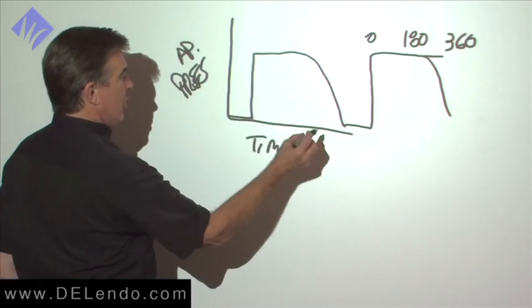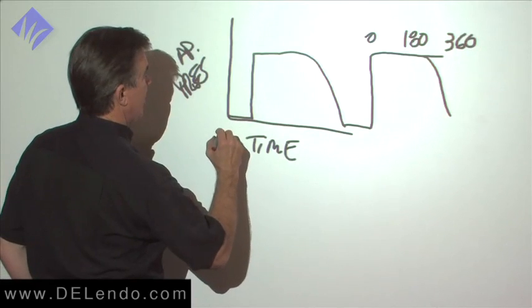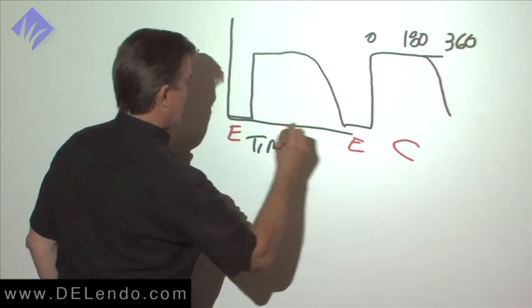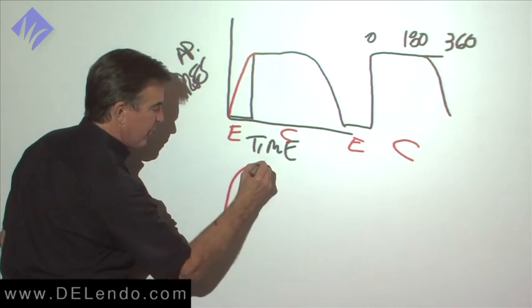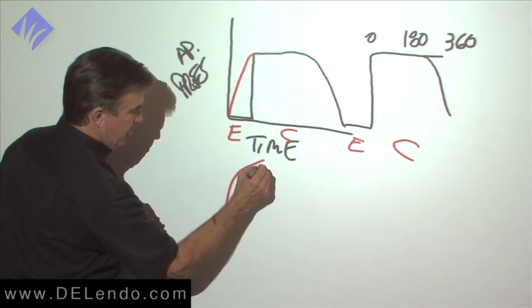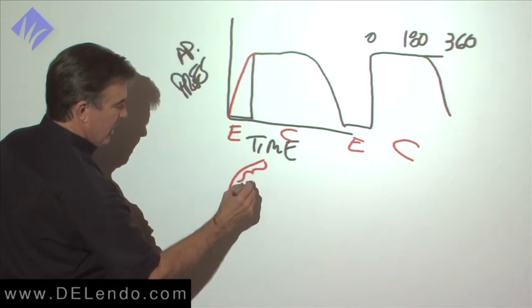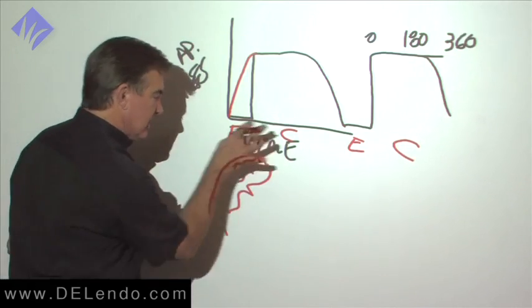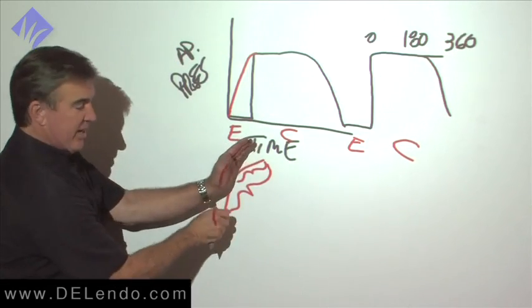Okay, if we put too much pressure on the engagement stroke, we over embed the flutes, and so instead of embedding, say, 2 or 3 millimeters, we start embedding, you know, half the file because it's over engaged, then you're not going to be able to cut through there. You're just going to twist the blade off below it.